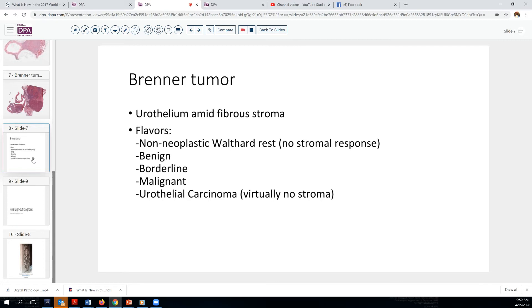So this is an example of Brenner tumor, defined as urothelium in small nests amid a fibro-thecomatous stroma. It comes in several flavors: the potential precursor lesion is the cystic Walthard rest, which has no stroma associated with it. There's the benign Brenner tumor, which is the most common. The epithelium can become atypical with features of dysplasia, in which case the lesion is termed borderline. And there are characteristic malignant Brenner tumors, though these are quite unusual — in which case the epithelia must be clearly malignant, have an invasive component, and be associated with this characteristic stroma. If you don't have the stroma but you have the malignant epithelial component, then we would term it urothelial carcinoma.